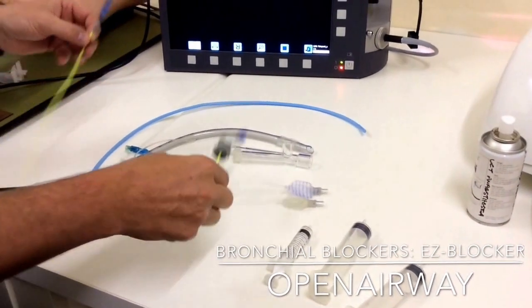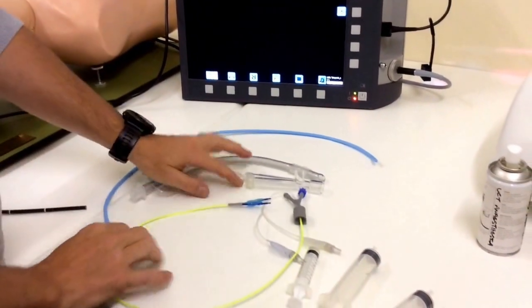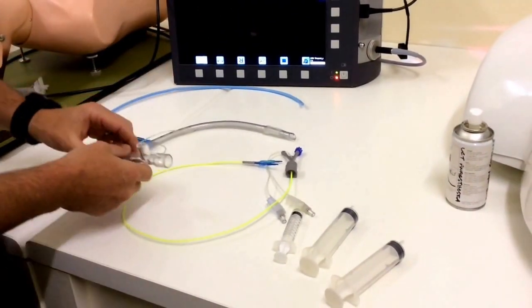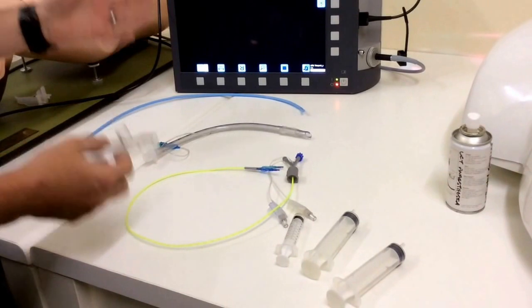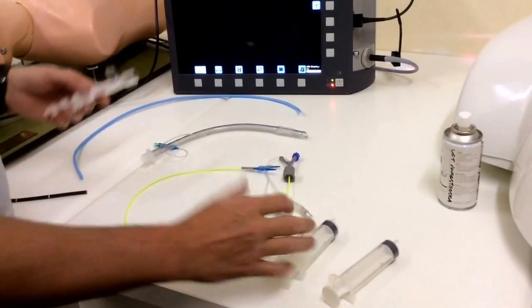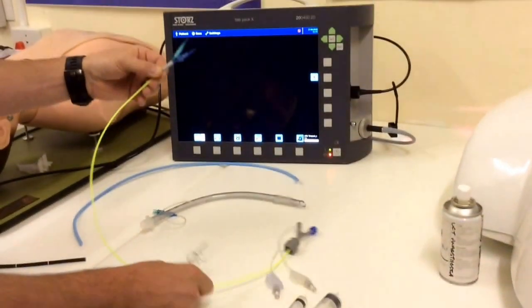The EZ Blocker is used for thoracic procedures and some cardiac procedures. It comes in a package with its wire connector. You're going to need a large size endotracheal tube — an 8 or 8.5 is usually fine — an endoscope or flexible fibroscope to position it, and a syringe to inflate your cuffs.